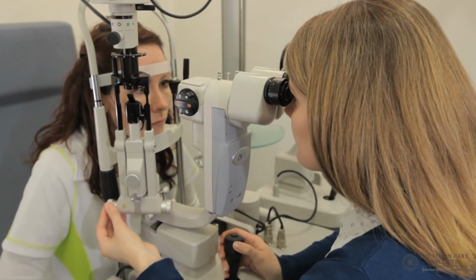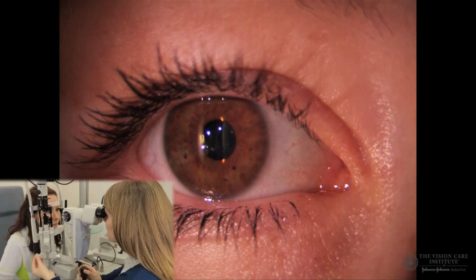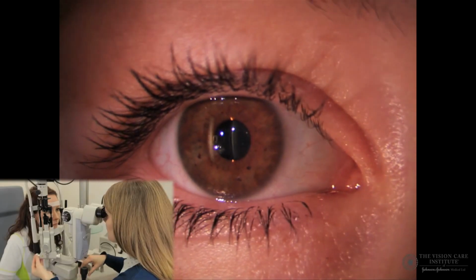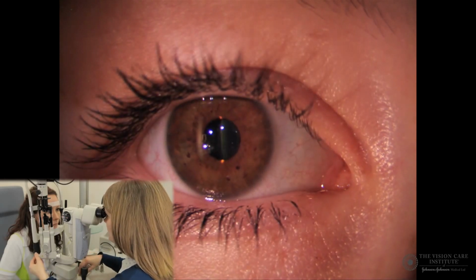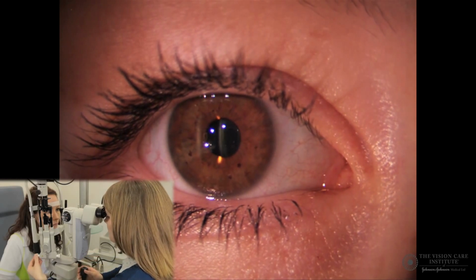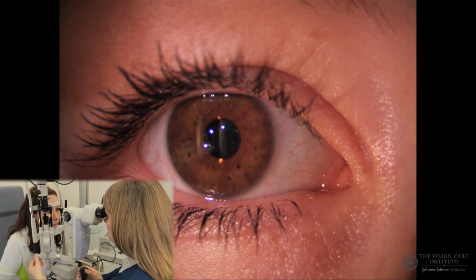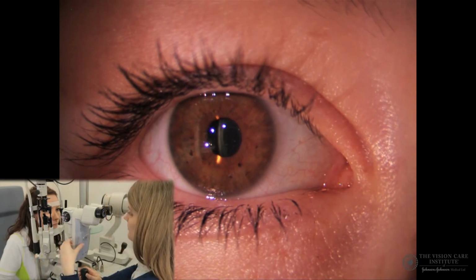In order to conduct this technique, the first thing we need to do is to form a nice clear section of the anterior part of the crystalline lens. This should be formed so that the anterior surface of the crystalline lens is positioned at the centre of the pupil. This is one element of the technique that will ensure that a reduction in pupil size will not interfere with the formation of the reflection.